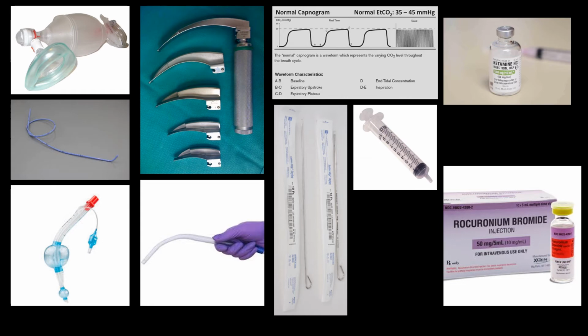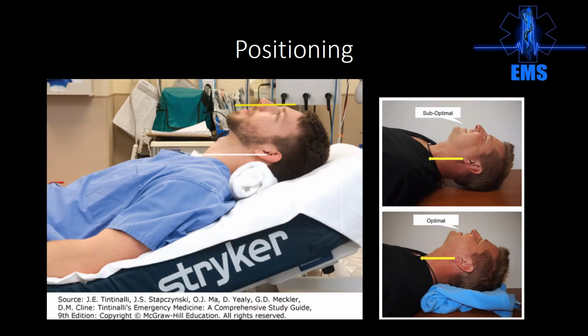And then I'm sure you've all seen the end-tidal CO2, but that's what I was talking about. Sharp incursion or sharp upslope, followed by the plateau, followed by a sharp deceleration and drop-off. You don't want the shark fin. Shark fin is indicative of people who are stacking breaths, who have auto PEEP, and those are going to cause you problems during that transport. The patient's going to become either hypoxic or hypotensive.